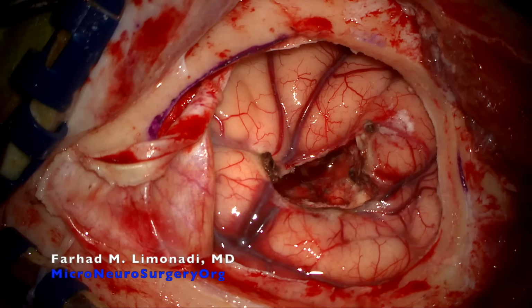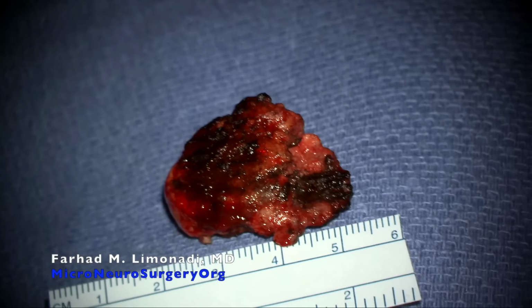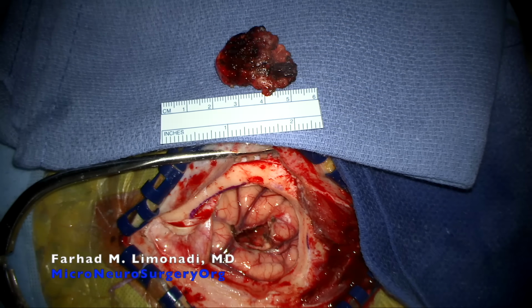This tumor of approximately 3 centimeters in size was removed through a brain corridor of nearly less than half its original size, minimizing frontal lobe injury.